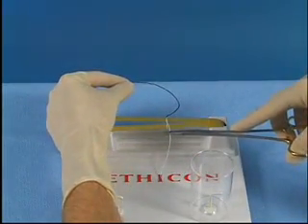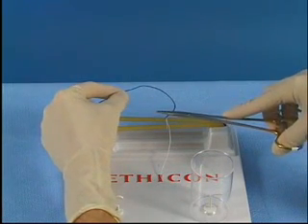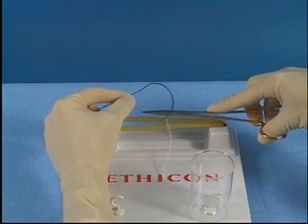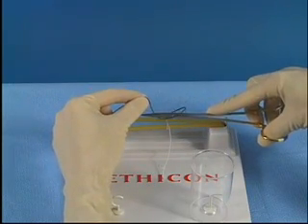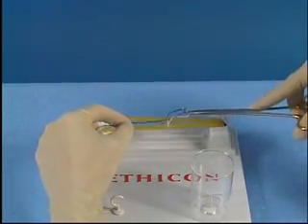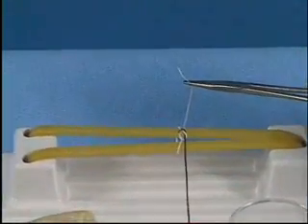The suture is released with the instrument while the non-dominant hand maintains control of the other end of the suture. The instrument is again placed over the incision between the two strands. The suture material is wrapped around the instrument. The other end of the suture is grasped and pulled away from the surgeon, forming a square knot.